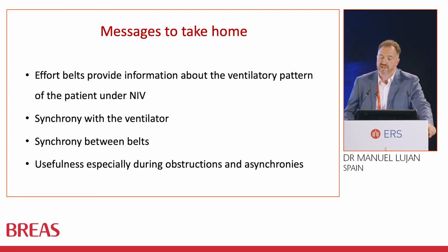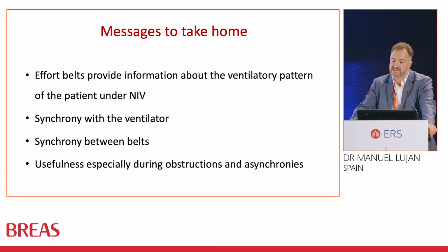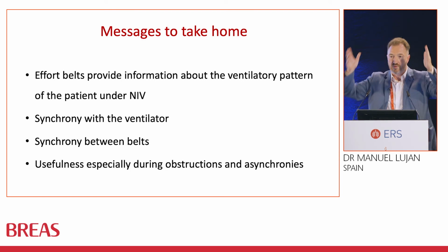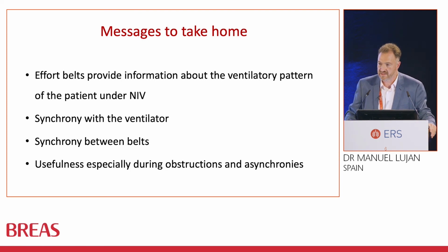Well, my take-home message: effort belts provide information about the ventilatory pattern of the patient under NIV, and we can get information in 3 different points. First, the synchrony with the ventilator, read in vertical; second, the synchrony between the belts; and third, the usefulness, especially during obstruction and asynchronies. Thank you very much.